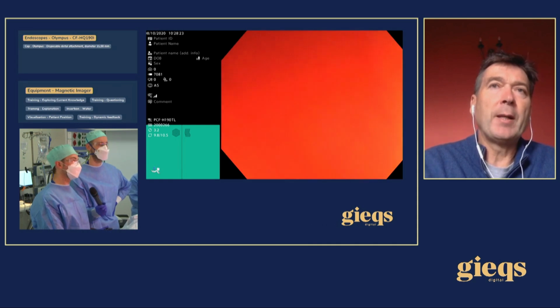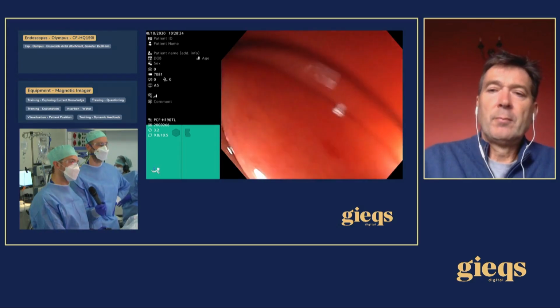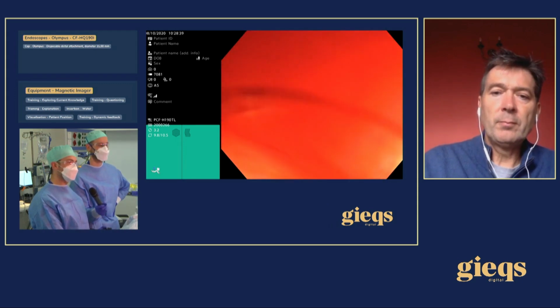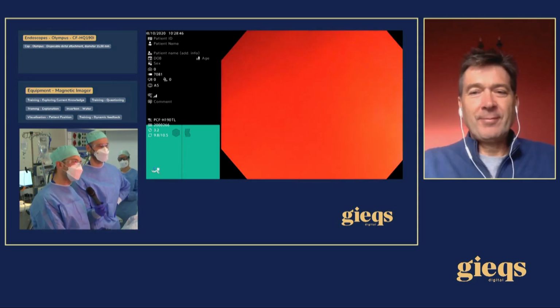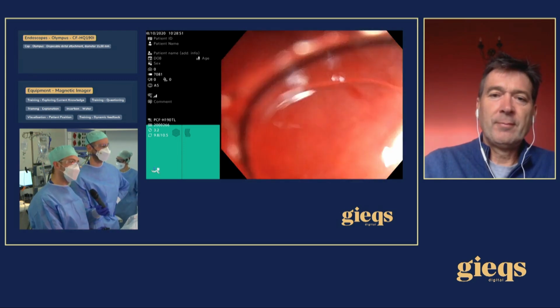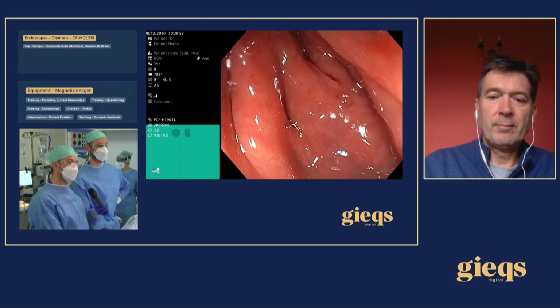They have to have buy-in, and what the tracking devices do is get buy-in to what you're trying to teach them. I noticed it, John. I mean, I was watching Christophe do the colonoscopy before, and you said, don't use water in the rectum. I was like, how does he know that we're still in the rectum? And of course, John is just looking at the scope guide, and that's how he trains, that's how he knows what's going to happen. You watched yesterday's beautiful insertion video, and that's how he's able to, because he's a master of the imager, the master of the front and back view as well, and that's how he knows.